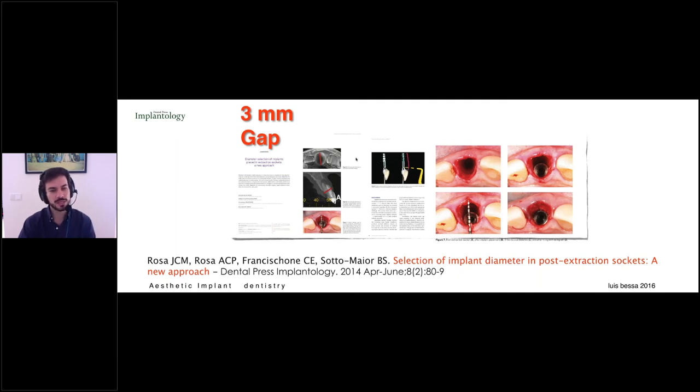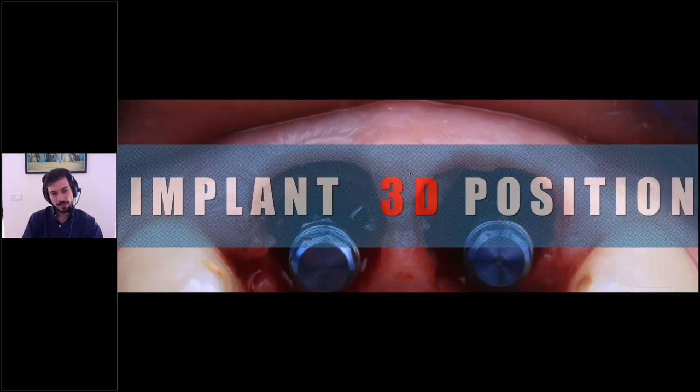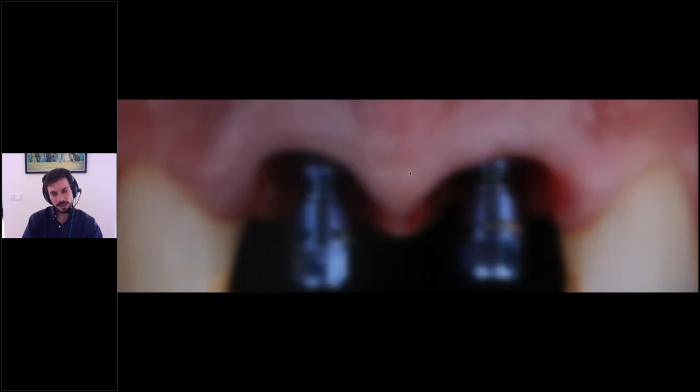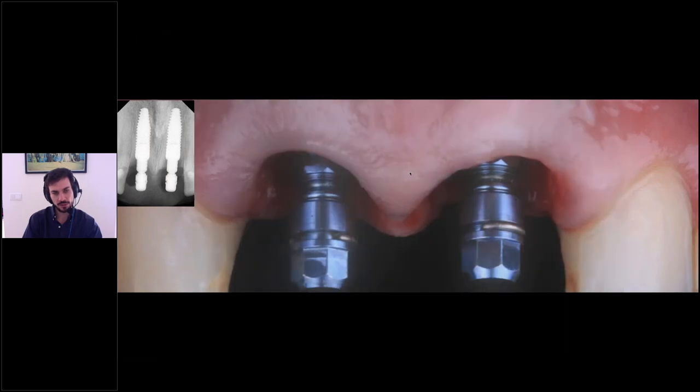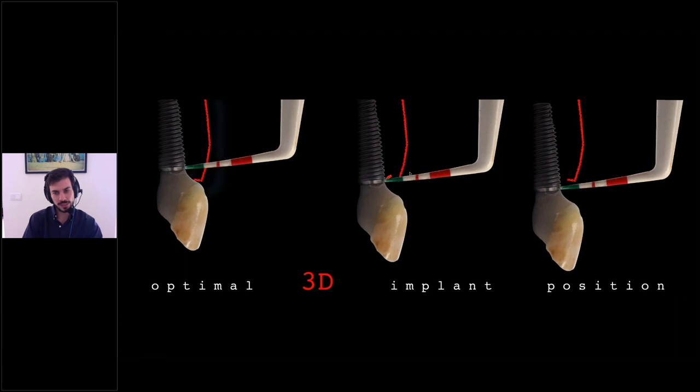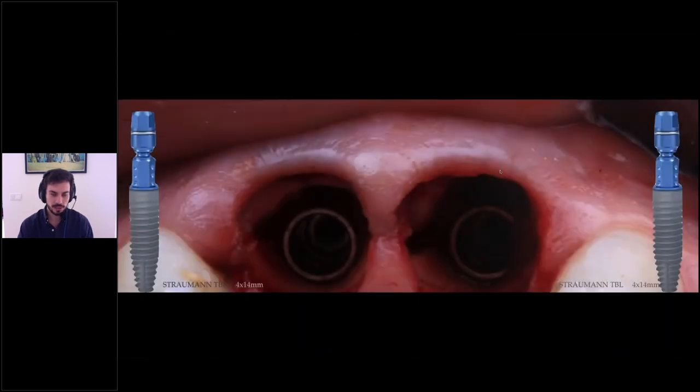We can have complications when we are dealing with the prosthetic part of this technique if we do not have enough room for the emergence profile of our restorations. So the implant 3D position should be as palatal and as deep as allows us to construct a good restoration for our patients. Therefore, if we have our implant too deep, we're going to have different emergence profiles and different kinds of soft tissue ingrowth in each kind of procedure.